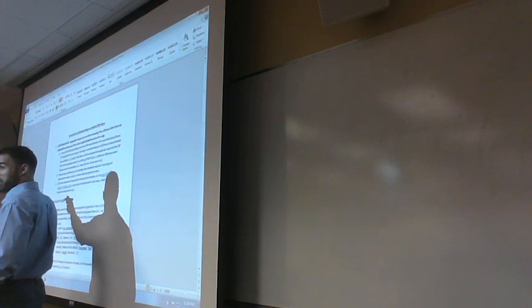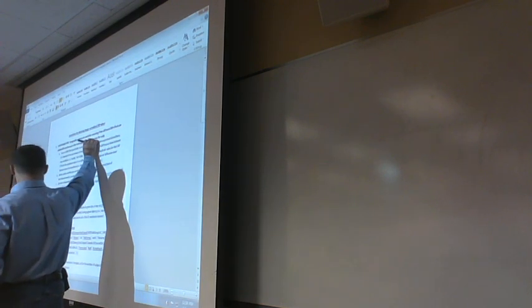Remember, an effect is a subtraction between two conditions. And so, for example, source correct minus source incorrect. So this is basically an introductory primer, and it gives you a link to that results section from the paper that we referred to that provides a much deeper coverage of the concept and the approach of topographic analysis. Okay, so we opened EEGLAB, we extracted our statistical measurements, so we got that now. This is a sample output code for how you can do that. You guys know how to derive those codes by typing ERPH in and getting something similar.